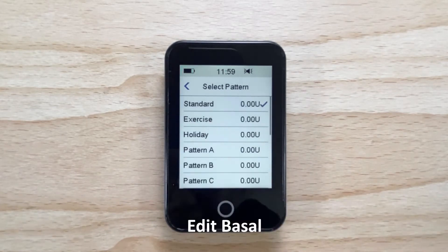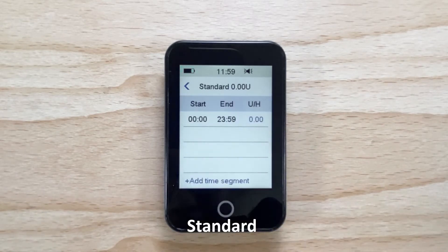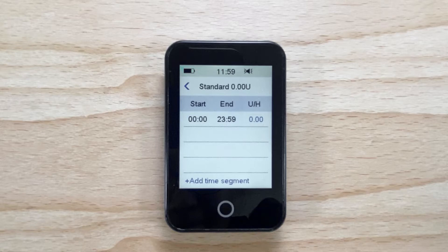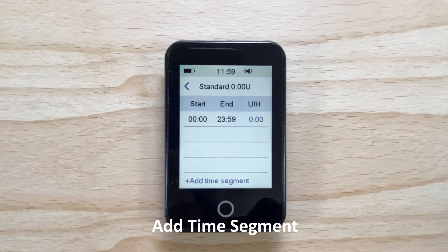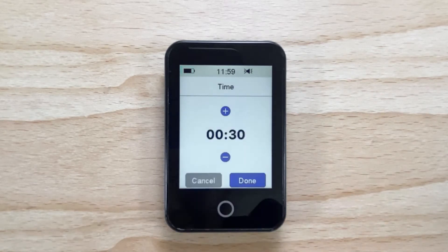Tap on edit basal. Tap on standard. You can add different time segments for the day depending on your need for different rates of insulin at different times. Tap add time segment to add a new time segment.